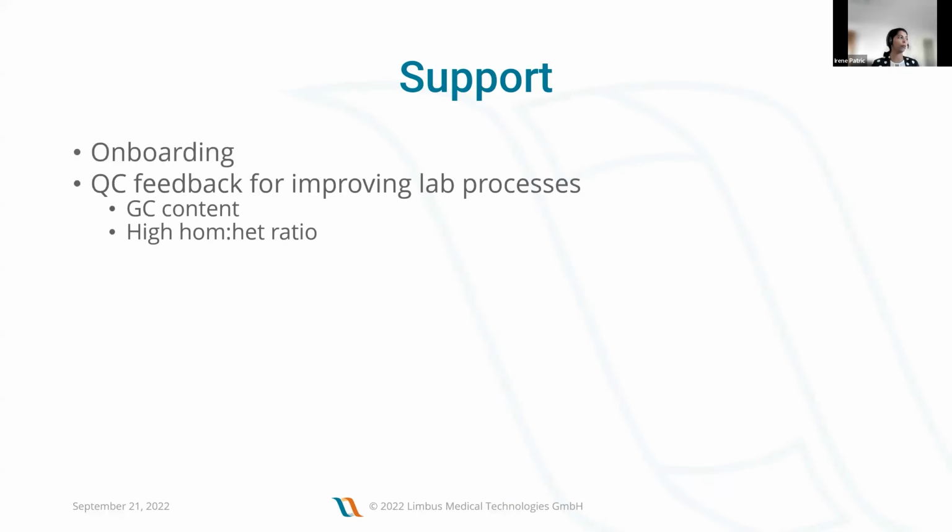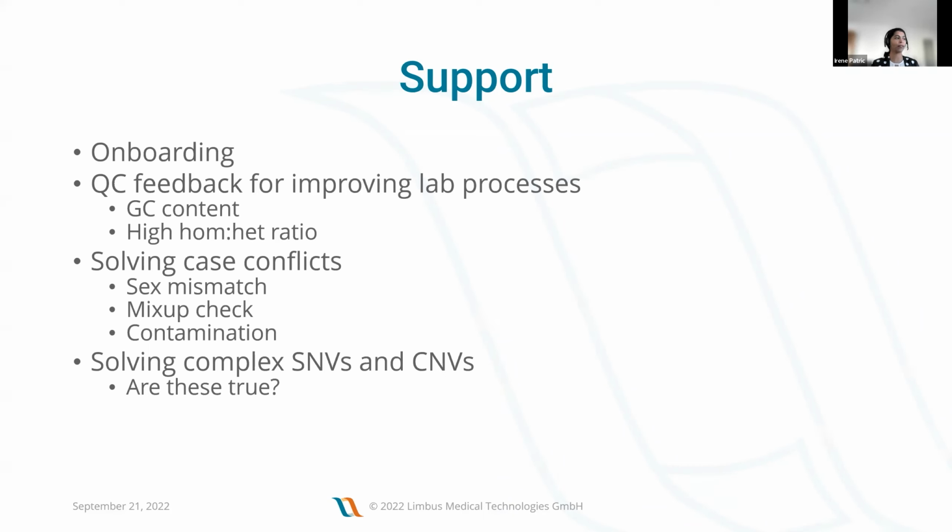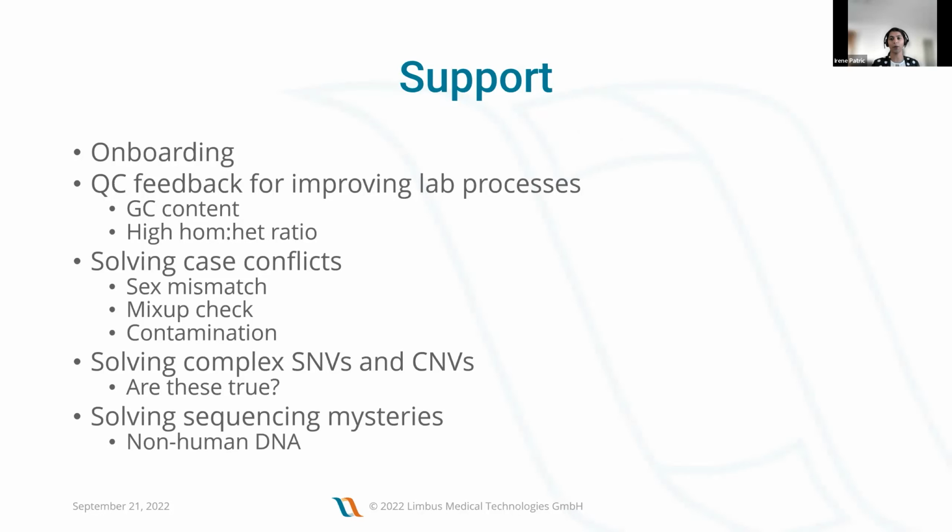So everything from onboarding, giving QC feedback, and solving several case conflicts, and complex questions about SNVs, CNVs, and several other questions that Lena will be showing in the following talk, will be better explained by her. So you will see that our support goes a long way along with the product. So with this, I will hand it over to Yvonne.